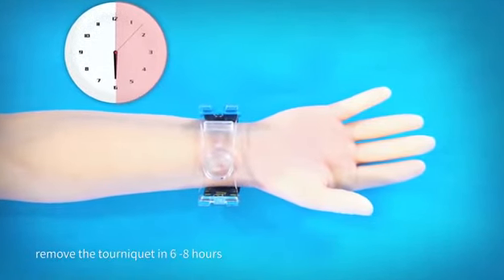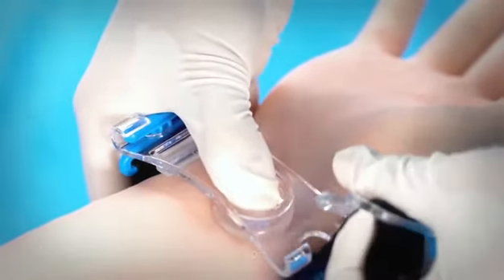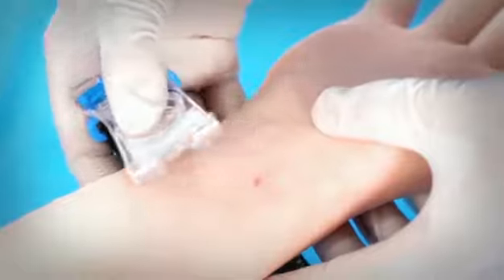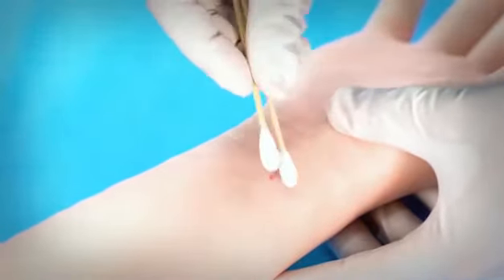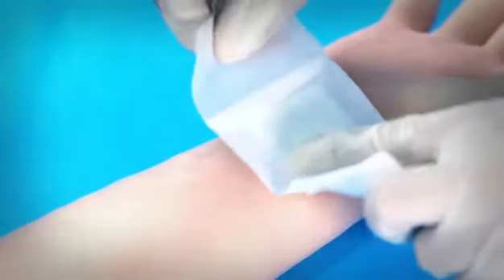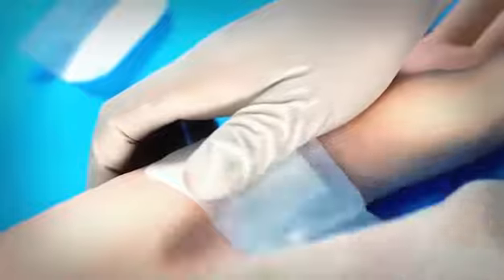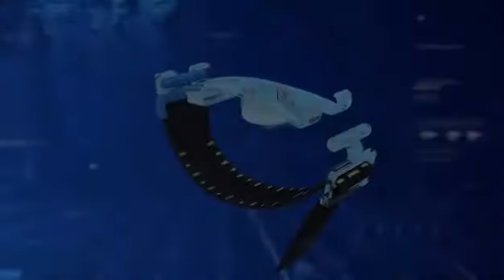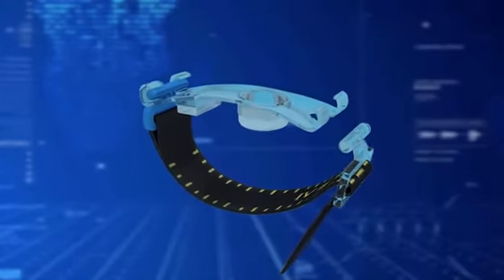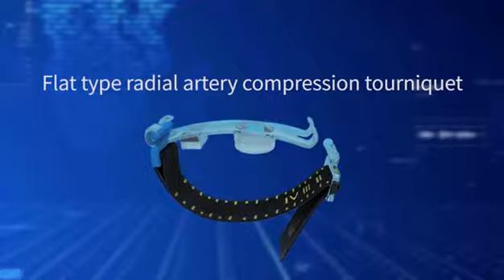Remove the tourniquet in 6 to 8 hours. If the patient's coagulation function is poor, extend the hemostasis time accordingly.